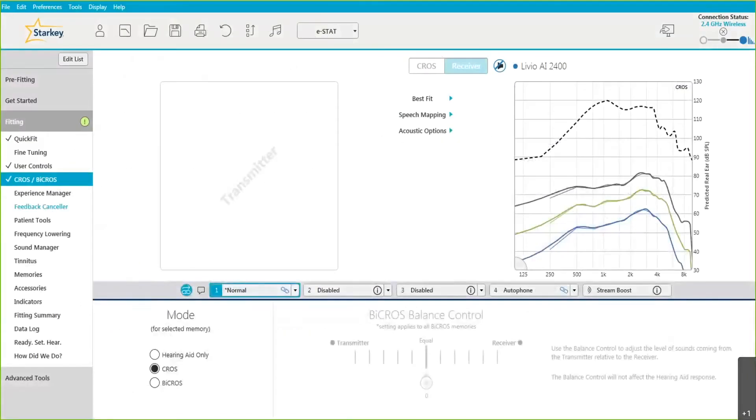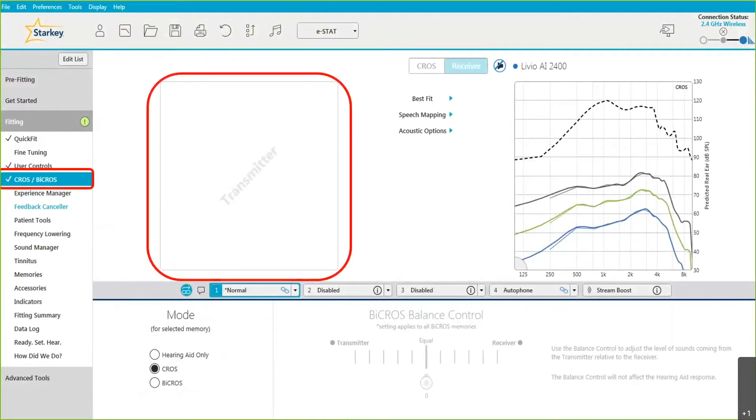When you enter the software, you'll see that on the left navigation bar there is a new screen option called CROS by CROS. You'll also notice on any screen that the transmitter side — in this case the right side — will have no fitting curves, as it's simply just a microphone with no amplification on that side.